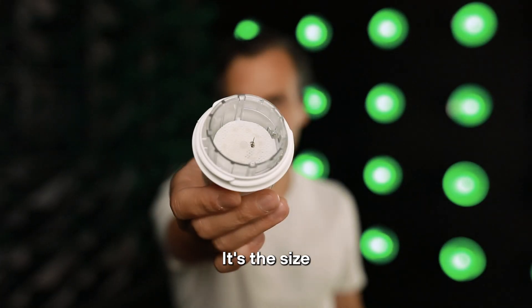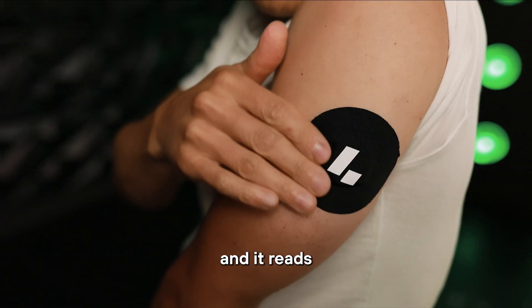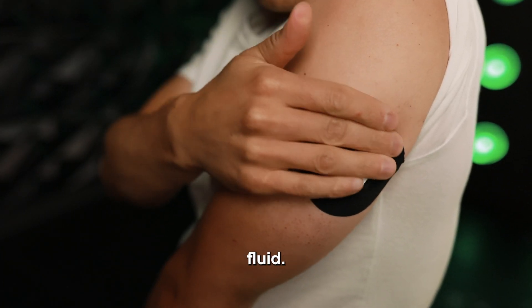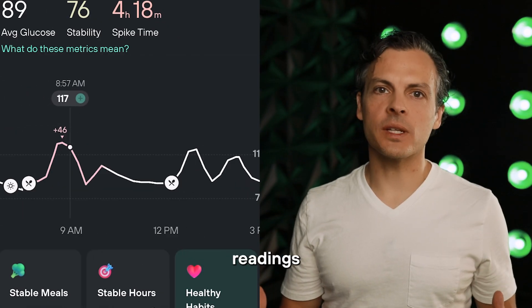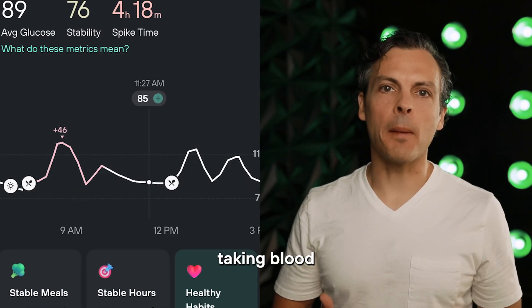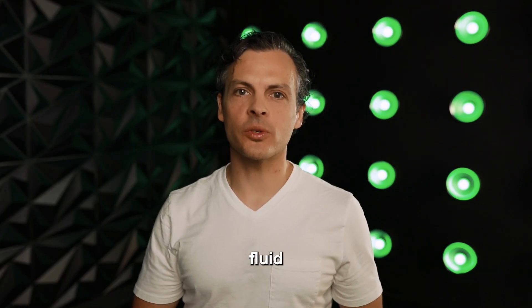The filament is quite small — it's the size of a couple millimeters — and it sits just below the skin, and it reads this fluid called interstitial fluid. It's the fluid just below your skin. That is where the glucose readings come from, so it's not actually taking blood glucose measurements; it's taking glucose measurements from the interstitial fluid.